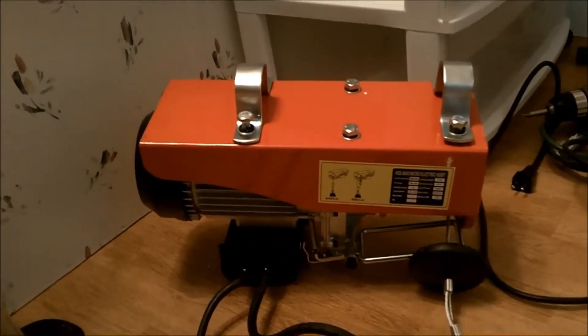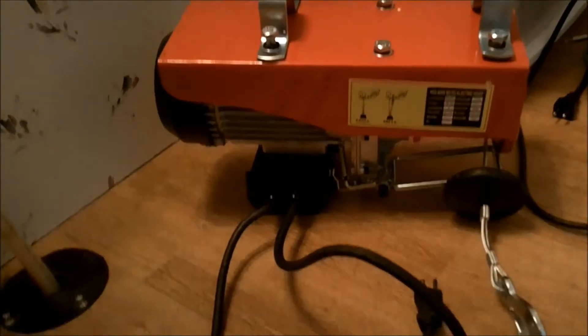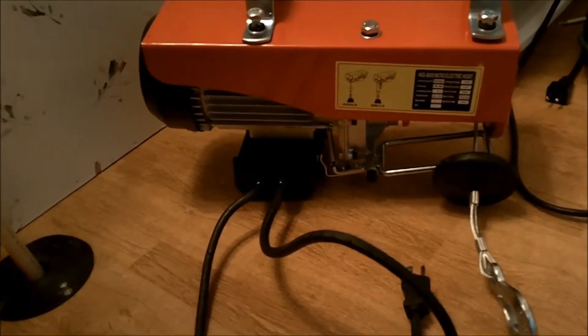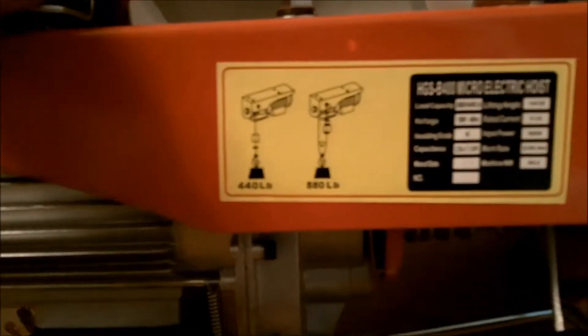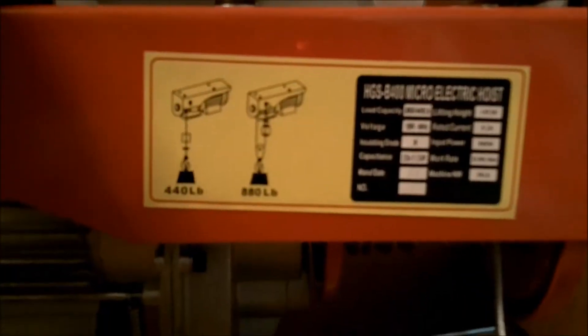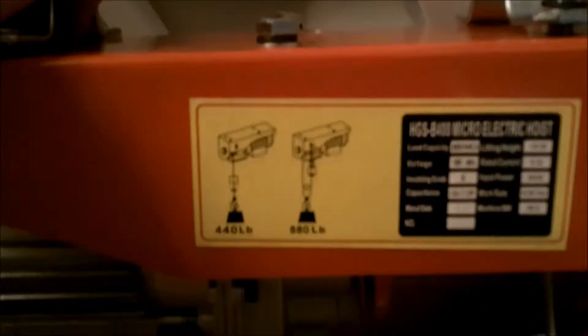This is a hoist — basically the same thing as a winch, only it's meant to pull things overhead. This particular one can haul 440 pounds with a single line, or if you use the double line option, it can hoist up to 880 pounds.